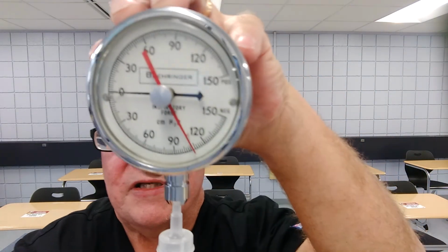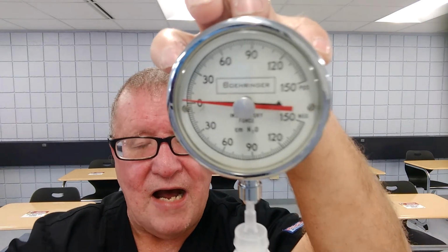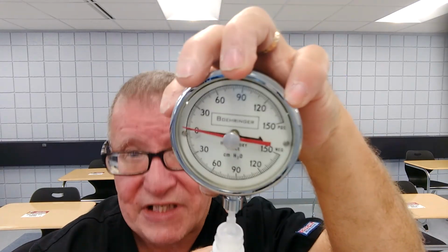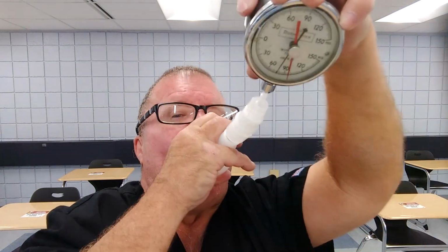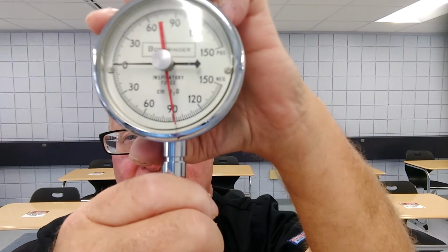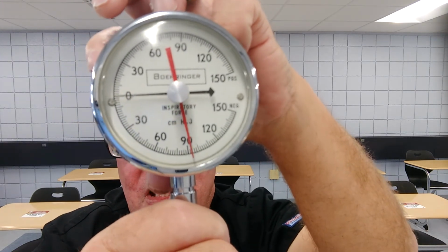Again, what I do, if you look at the face, you got the red needle and the black needle. The red needle I set all the way to 0 up against the black needle, like so, okay? I have the patient breathe all the way out to residual volume, and then suck in as deep as they can and as fast as they can. So all the way out, breathe in, and if you'll see, that red needle moved. My red needle moved to minus 92. Minus 92 is the number.